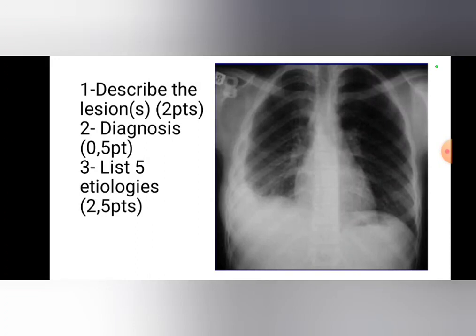The second element you can see is the blunting of the costophrenic angle, and you also have the meniscus sign. So to summarize: you have a homogeneous opacity in the right lower lung field, blunting of the costophrenic angle, and the meniscus sign.